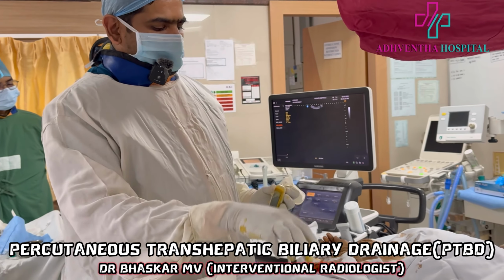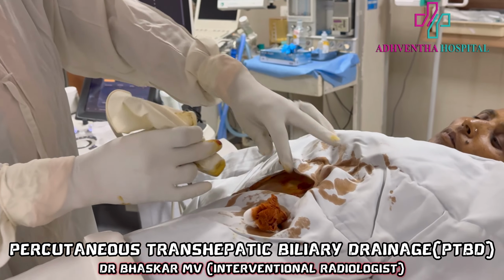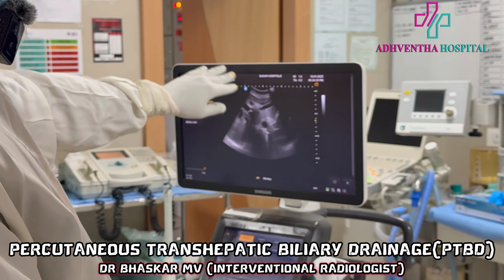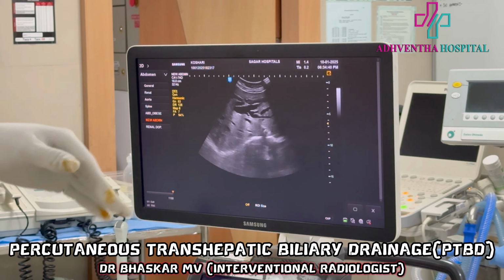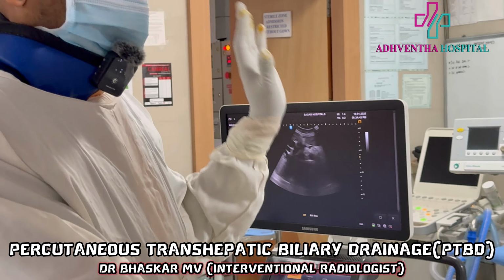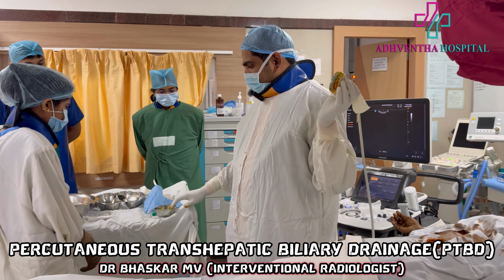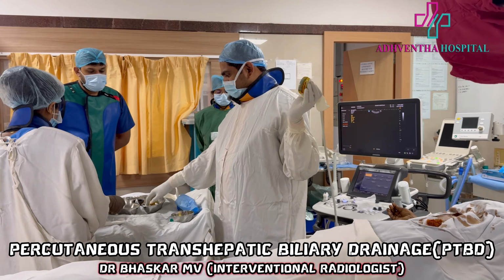What we should do? This is a cath lab, we are doing a percutaneous biliary drainage procedure. This is the epigastric region. We are planning to puncture the left lobe of liver, biliary radical dilatation, and then we will try to internalize the tip of the catheter into the second part of duodenum and drain out the distended biliary radicals so that the complete relief of jaundice will be there. Let's go for the drainage procedure. This is called percutaneous transhepatic biliary drainage, PTBD, in a simplified manner.